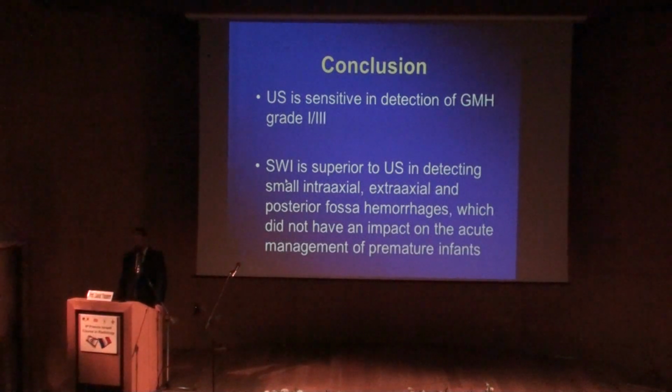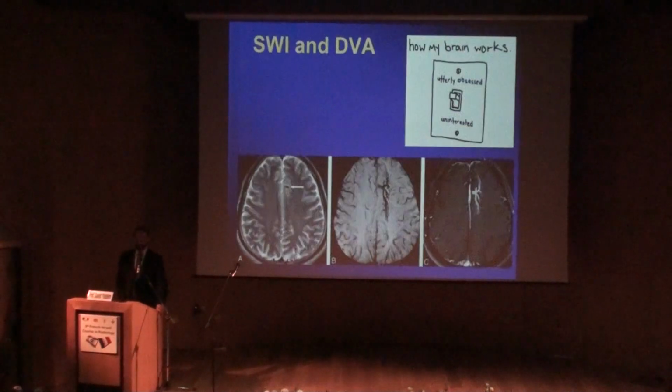So we found that SWI was superior to ultrasound in detecting some small intraaxial bleeds, some posterior fossa bleeds, as well as some of the extraaxial bleeds, but it really didn't affect management, and we're not advocating switching any time from ultrasound to SWI.